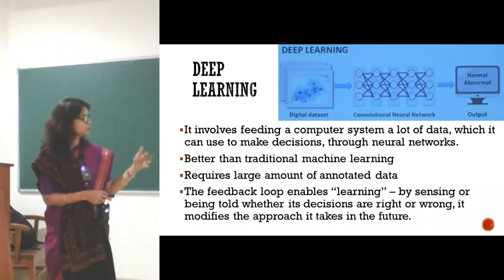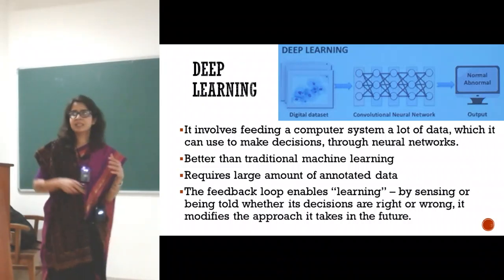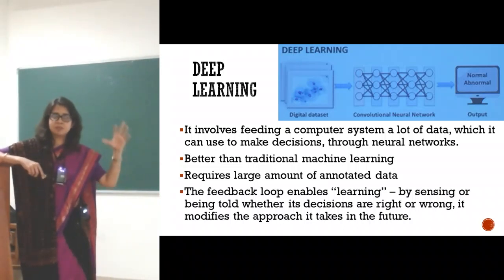I'm not going to get into explaining that to you, but it helps in giving results. Like I explained, I can't see on the slide which is a poor prognosis tumor and which is a good prognosis tumor.